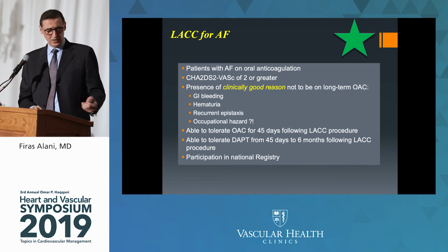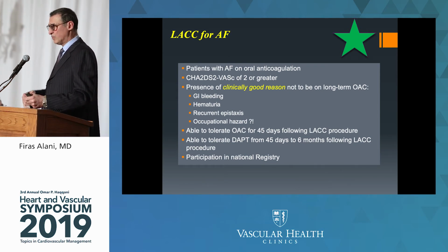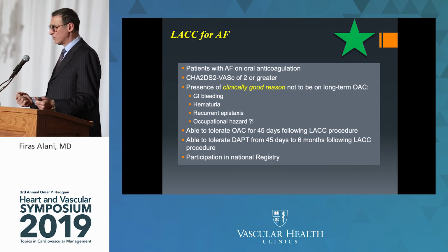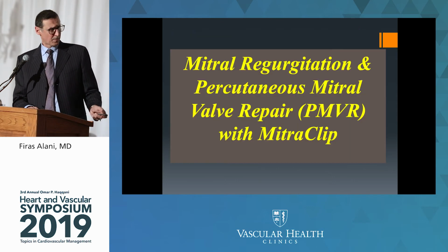Some of that wording has been extended to job hazard. So the firemen and policemen who have atrial fibrillation, and whose job puts them at risk of getting injured and bleeding from the anticoagulation, those patients are now being approved for the Watchman device.